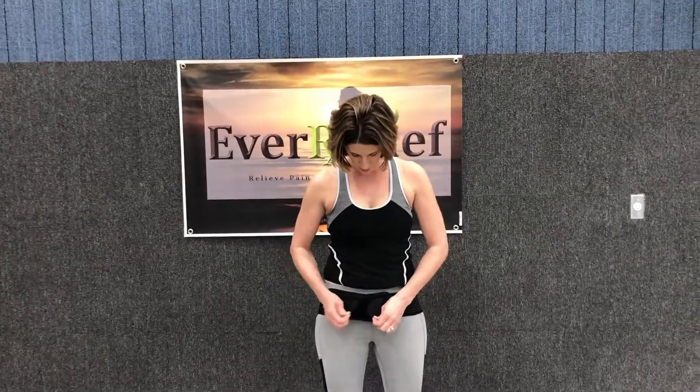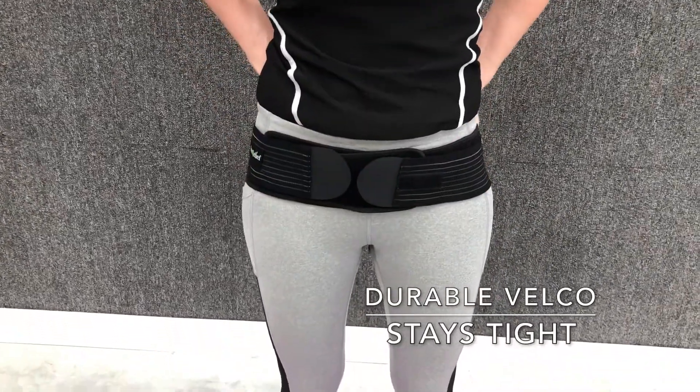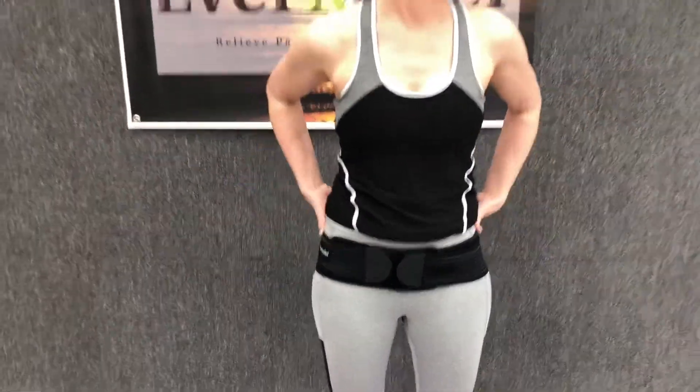It's got non-slip material and very durable velcro, so it will stay in place and stay as tight as you want it. You can take it with you — throw it in your purse or your briefcase — and have it whenever you need some support.